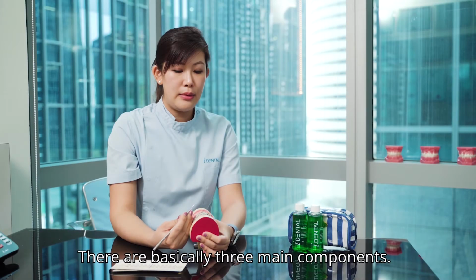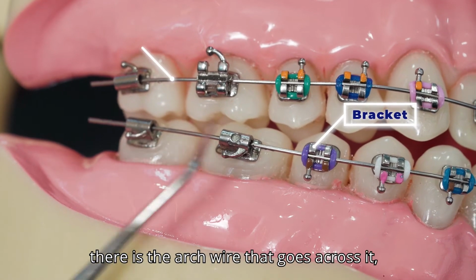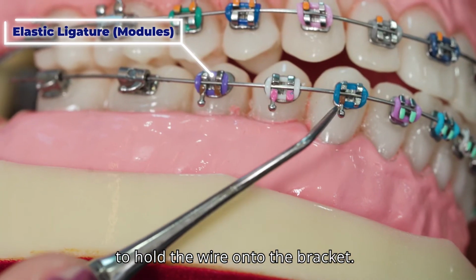So there are basically three main components. There's the bracket, there's the arch wire that goes across it, and then a little elastic module, like a little rubber band that they use to hold the wire onto the bracket.